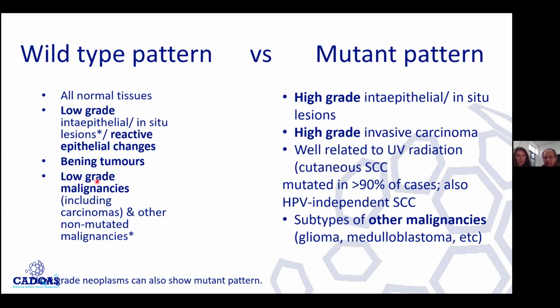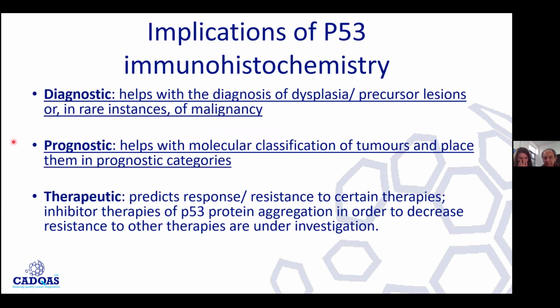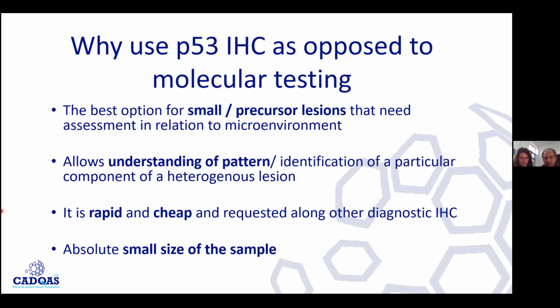normally. But don't be surprised if, for instance, you have low-grade dysplasia and you do P53 and you find a mutant pattern, because that's not uncommon. Now, these are the things we're going to focus on, the diagnostic and prognostic input from P53.